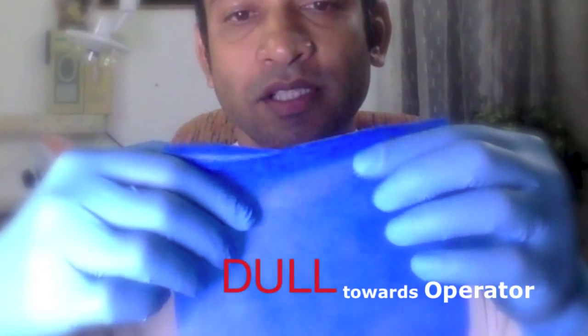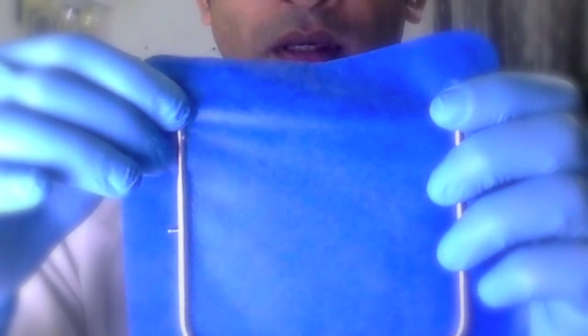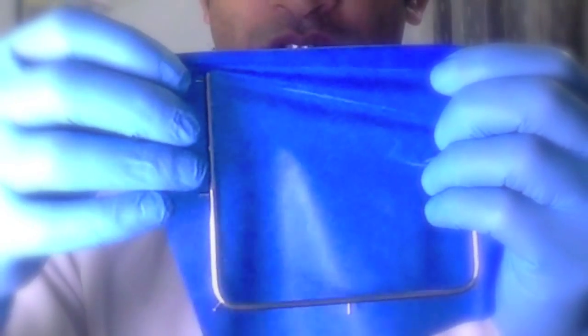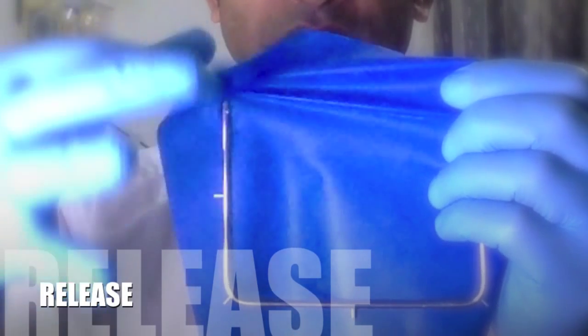What I have in front of me is a rubber dam frame. The frame is kind of curved to follow the curve of the jaw, and your first step is to place this rubber dam material onto the frame. This rubber dam material consists of a glossy surface as well as a dull surface. The dull surface should be facing you at the operator, whereas the glossy surface should face the patient. The first step is to place the rubber dam across the frame and begin to secure it by pulling, pressing against one of those little pokey tines, and then releasing. You'll see that it secures by itself.